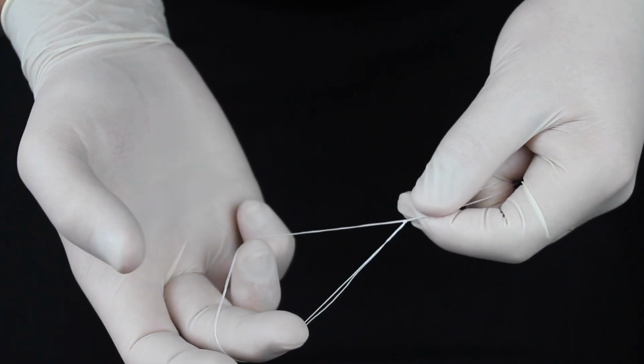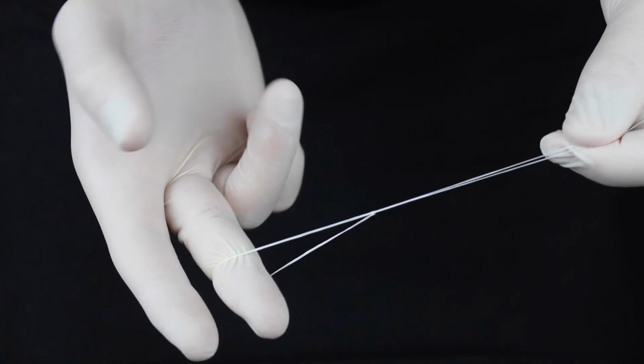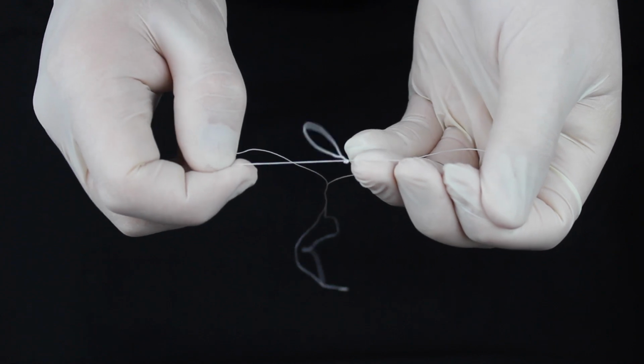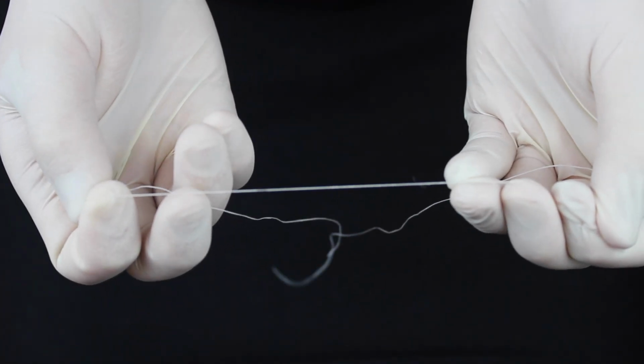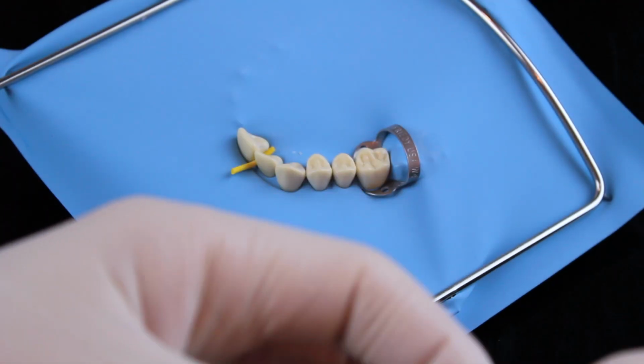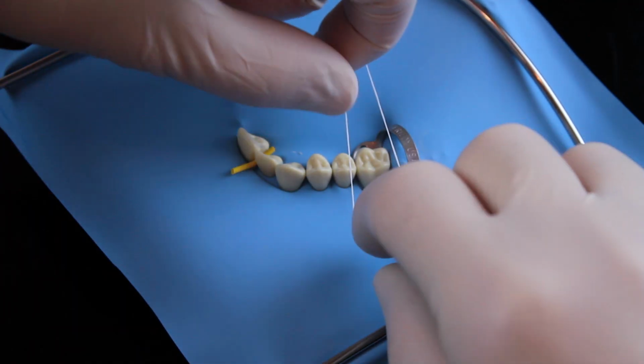The advantage to the double loop is that it can be tightened with one hand with a simple back and forth motion. The disadvantage is that it's double in thickness. The knot will also undo itself if you pull strongly on both hands. So now that we know how to prepare the knot, let's go on to the application.